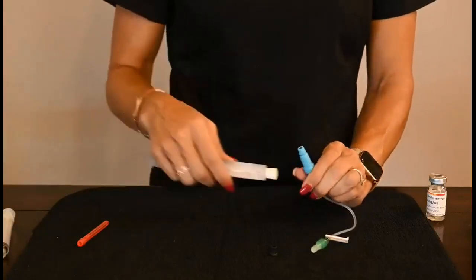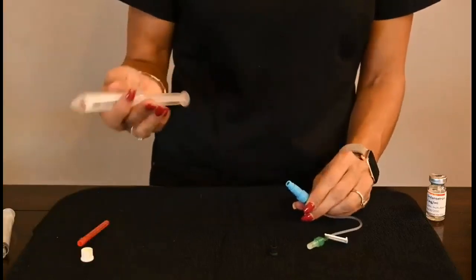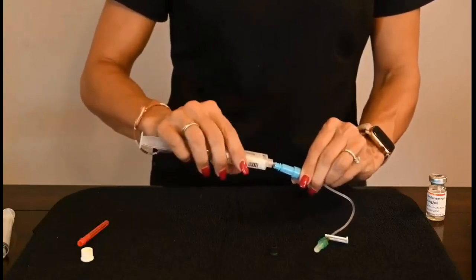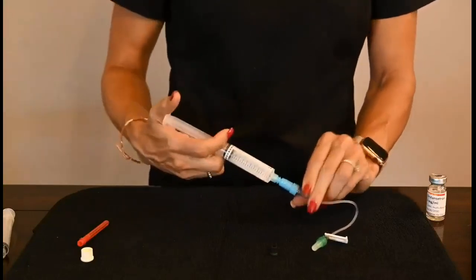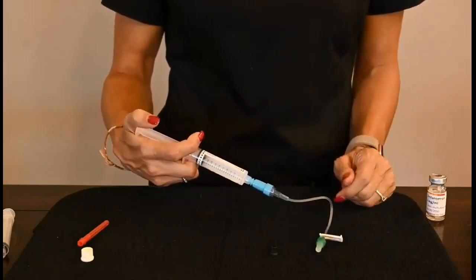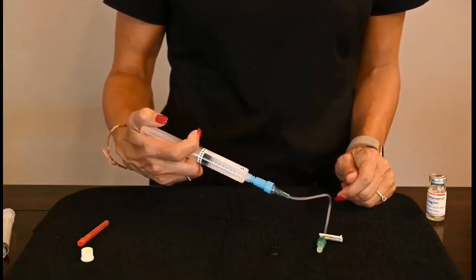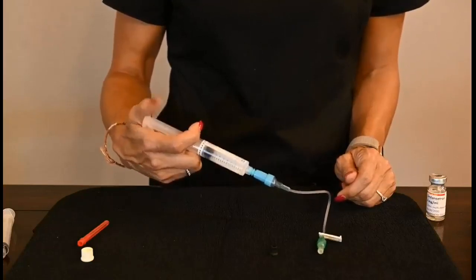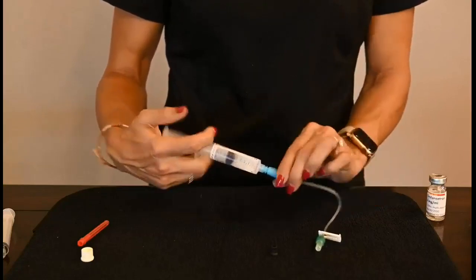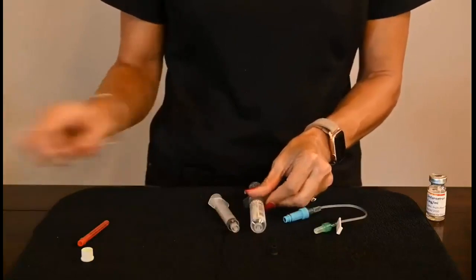Then I'm going to get my last syringe of flush, and remember, because this is just a peripheral line, I only need 3 to 5 mLs. I've already cleaned if I needed to. I'm going to push it on here. Now remember, it still has medication in here, so we need to go slow at the beginning. So I'm going to go really slow for the first like 1 to 2 mLs, and then if I want to finish at the end, I would just push pause, push pause. That's what we mean by saline, administer, saline.